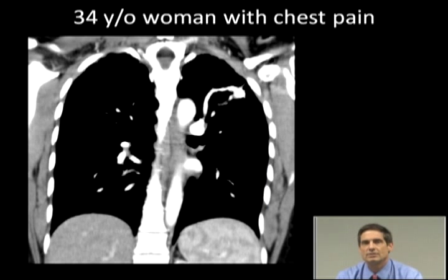This turned out to be an arteriovascular malformation. On this coronal study, you can see the contrast coming into the lesion from the hilum. It's a huge feeding vessel into this thing, and there's also a huge draining vein out of it. And basically, this is a huge AVM causing so much flow that it was causing the patient pain. This arrow delineates the lesion itself.